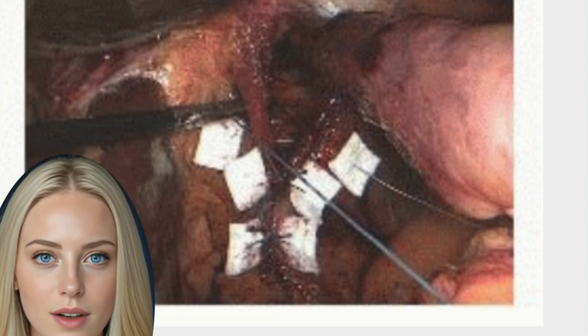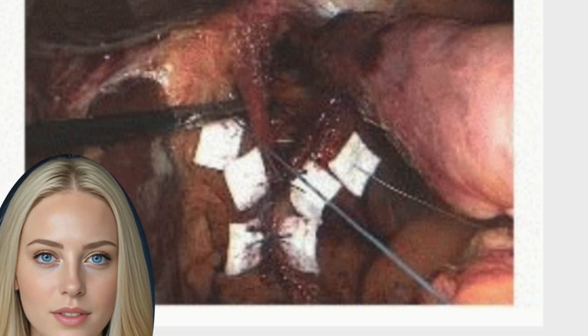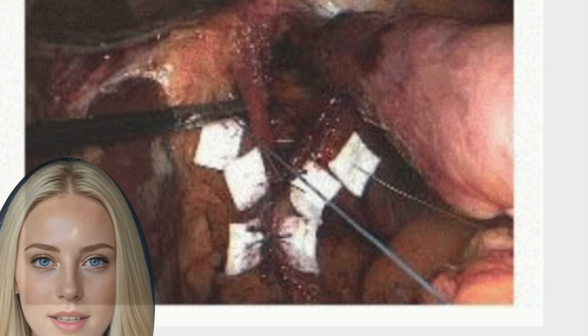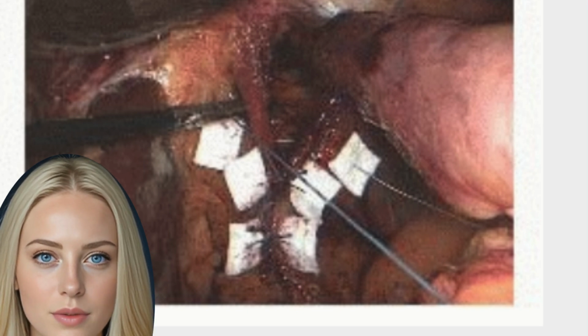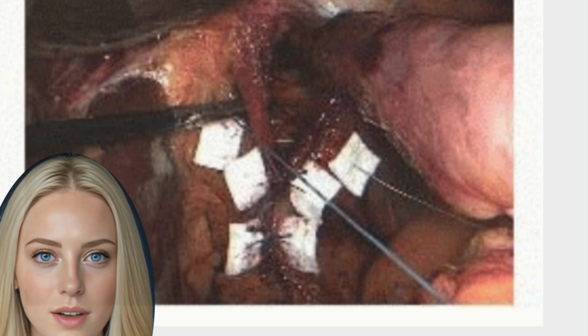Fundoplication takedown. If there exists a previous fundoplication and preoperative testing demonstrates incompetence of the antireflux procedure, the wrap is mandated to be taken down and redone. Extreme care should be implemented, as this is the step that carries the most risk of enterotomy either at the stomach or at the esophagus. Once completely dissected, inspection and reinspection of the taken down wrap should take place. Often, the gastric lumen may resemble the shiny planes between the fundus and esophageal body.